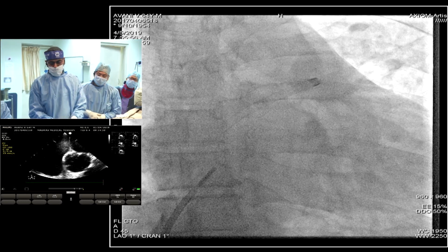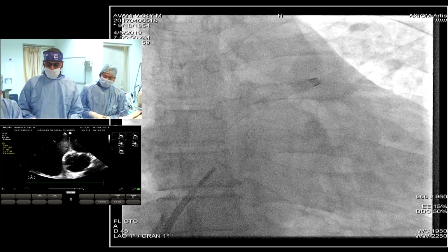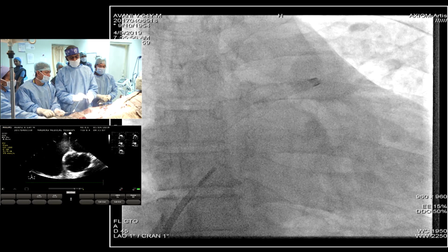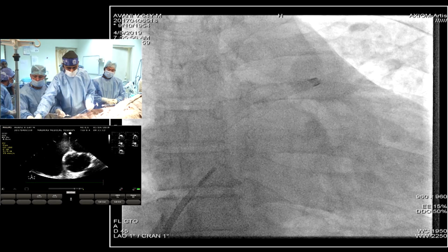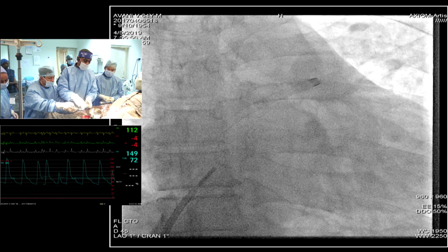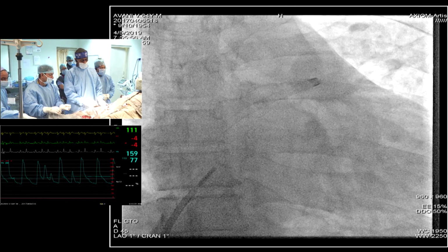If the ASD is moderate in size, then we have two options. In patients who have excellent transthoracic windows, we just do it on transthoracic echo guidance itself. But in a patient who is around 50 or 60 years, this gentleman is 64 years, who has not so beautiful transthoracic windows, we would like to use intracardiac echo. Intracardiac echo, in view of the expense of the probe, is not our preferred option in all cases. We do it very sparingly. The probe is prohibitively expensive.